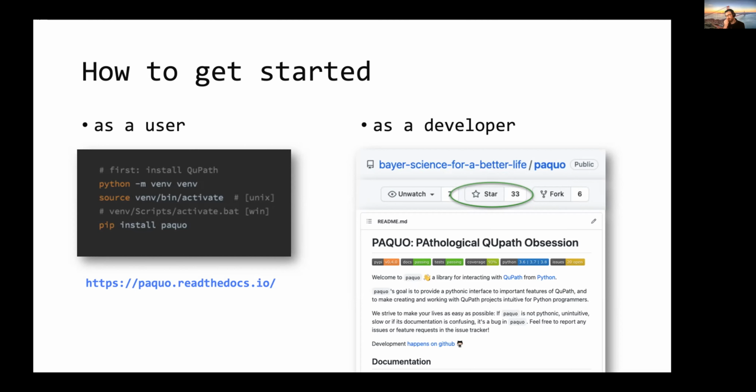Yeah, so basically the current implementation of the wrapper is doing things step by step. So there are ways we can improve speed by going into other APIs directly in the Java library, but we'd have to work on that.